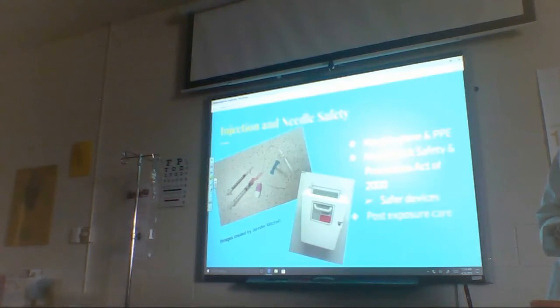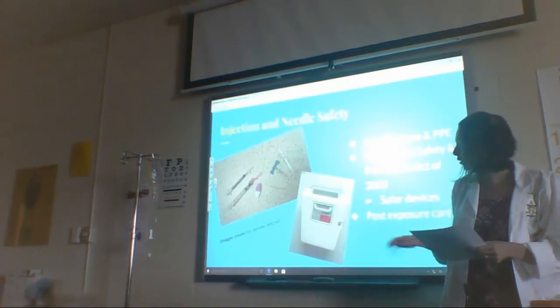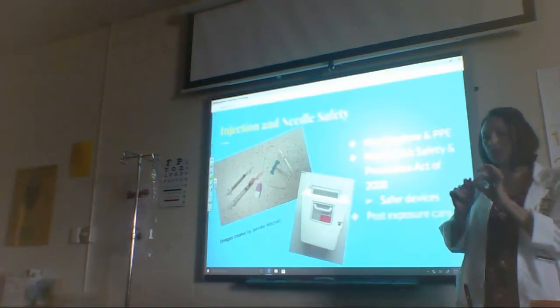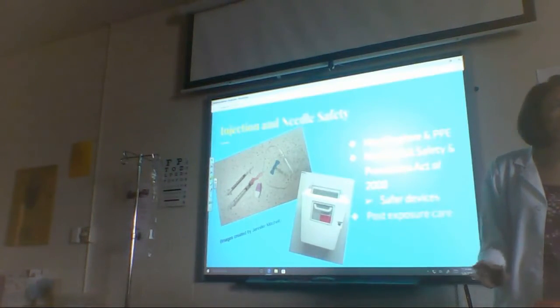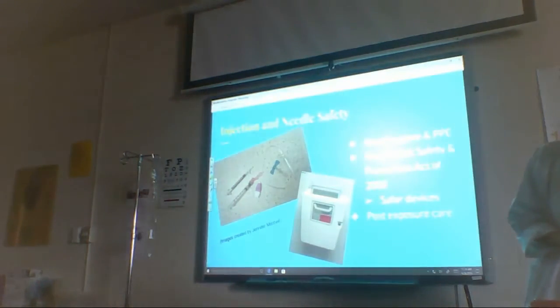11% was disposal-related activity. So how many people have ever tried to cram an extra thing into the sharps box? 11% of exposure comes from trying to cram things into overfilled sharps boxes. Activities after use and prior to disposal, such as item disassembly. So does it make any sense that once you've given an injection to unscrew the syringe from it and then try to throw it all away? No, that makes no sense at all. Don't do that. Everything should go as one piece with your Safer Needle Device clicked over it and into the sharps container, all at one time.